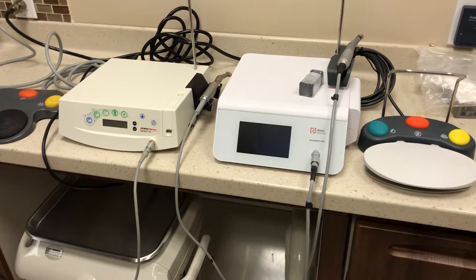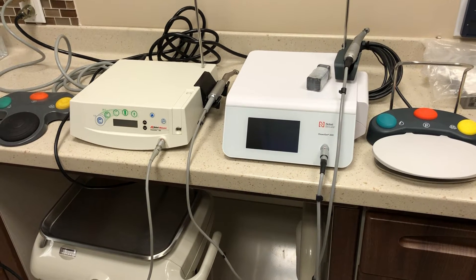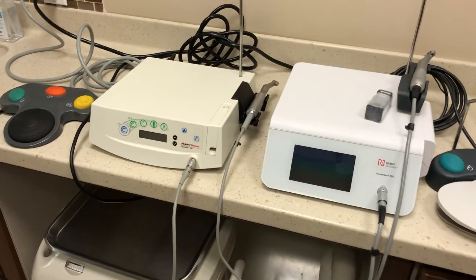Hey folks, what you see in front of you here are a couple of implant motors. These are the devices that help you place implants — they drill the holes in the bone before implants are inserted into the jaw.